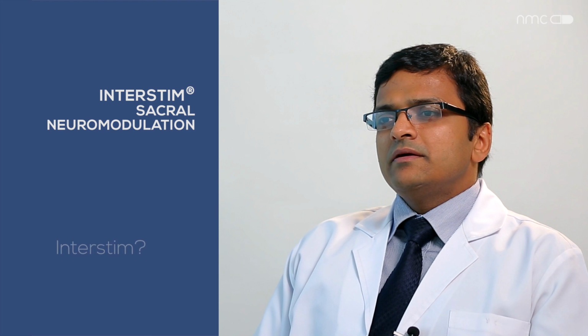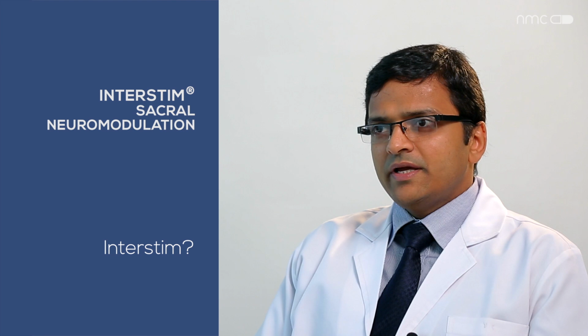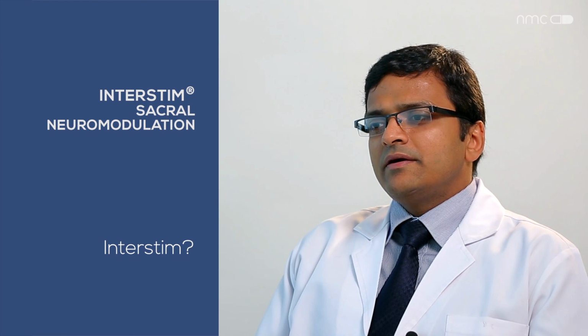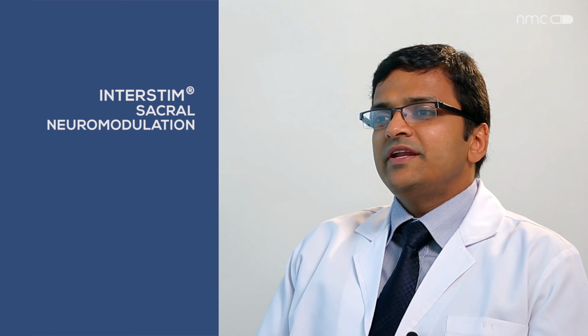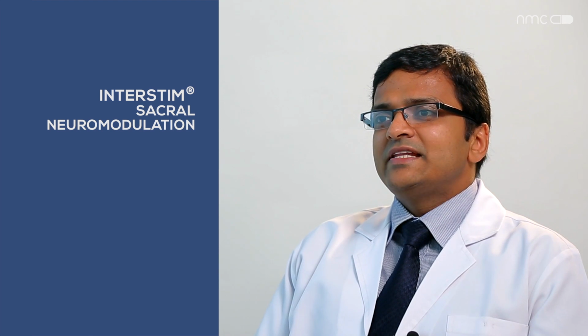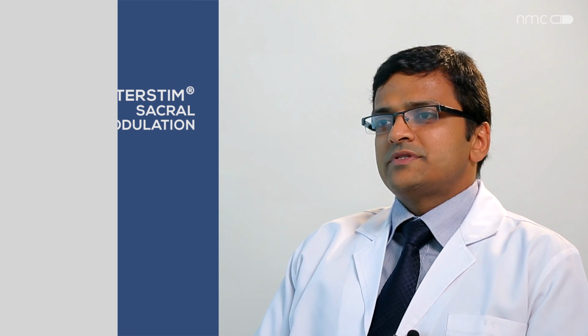Interstim is a proprietary pacemaker developed by a Medtronic company, and it helps in various pelvic floor disorders, which includes various urological applications also. So in one word we can say it's a pacemaker device developed for pelvic floor problems.